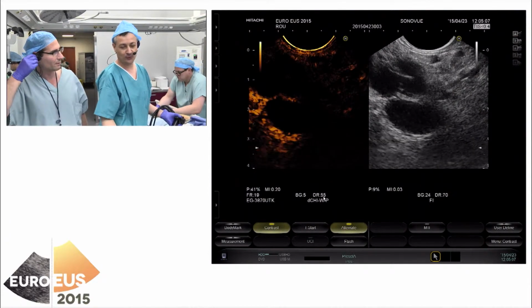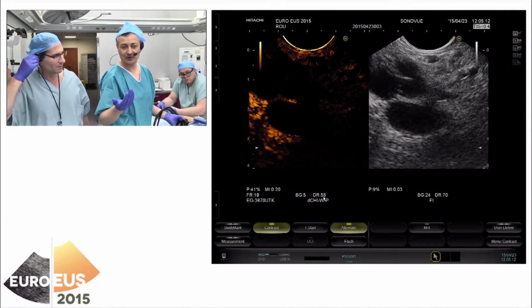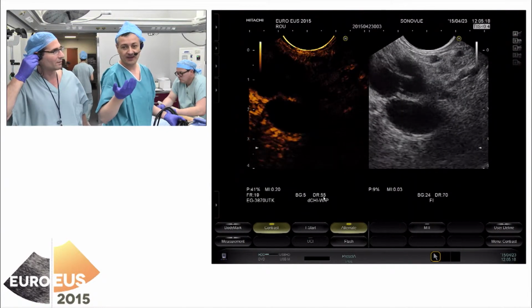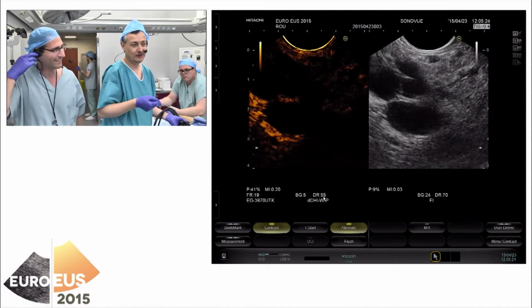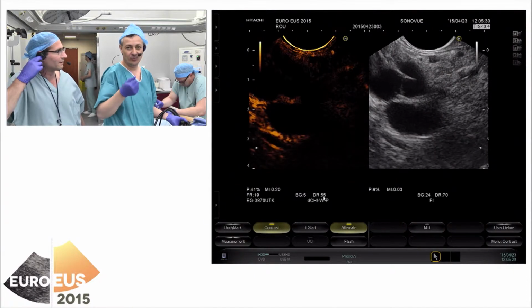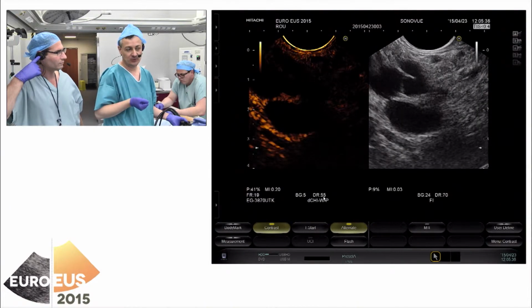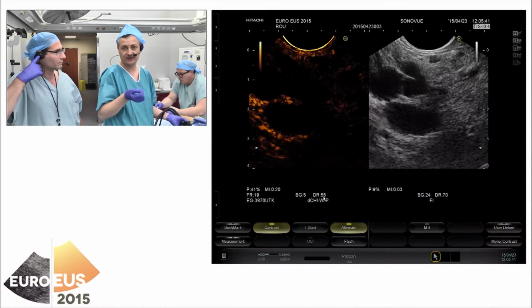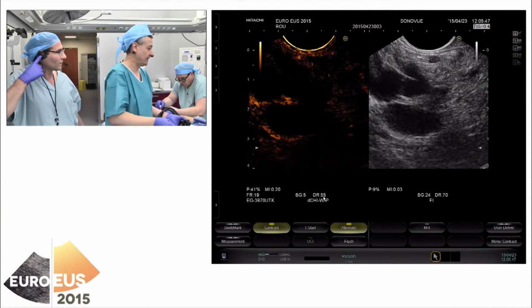In order to differentiate a solid pseudopapillary tumor, which has both solid and also some small cystic spaces sometimes. It's a bit unusual because it's not a young female here. Yes, it's a male. But nevertheless, in order to differentiate that, we need immunohistochemistry or immunocytochemistry. In solid pseudopapillary neoplasm, it's positive for beta-catenin, neuron-specific enolase and CD10, so there are markers which clearly differentiate that.